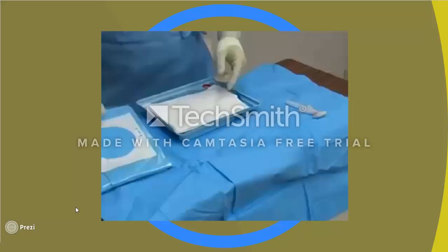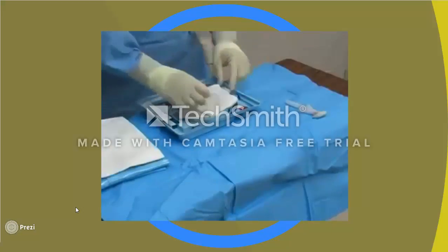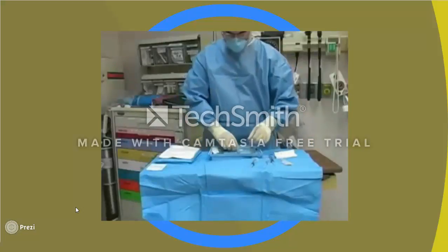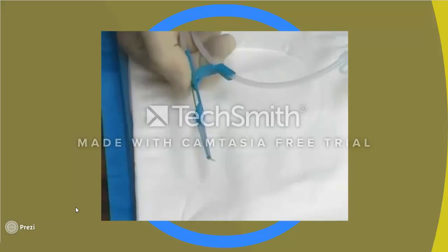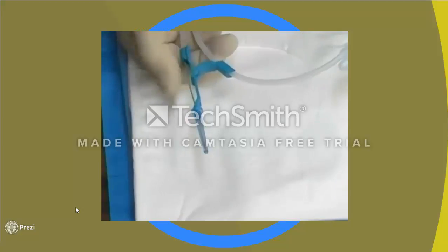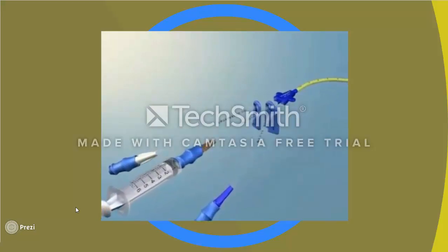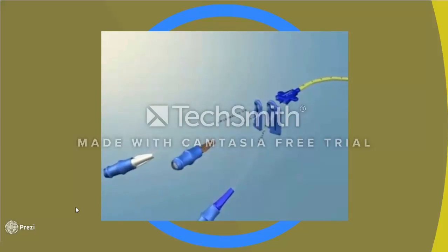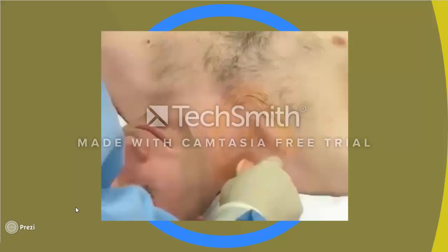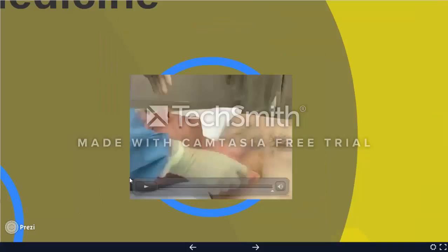Next, lay out the equipment on the sterile wrapping from the kit. It is helpful to arrange the contents on the table in the order that they will be used during the procedure. Test the guide wire to make sure that it feeds easily through the straightener sleeve and then retract it before proceeding. Pre-flush the ports of the triple lumen catheter with normal saline and leave the cap of the distal port removed so that the guide wire may be advanced through it. Cleanse the skin overlying the entry site with a chlorhexidine applicator.